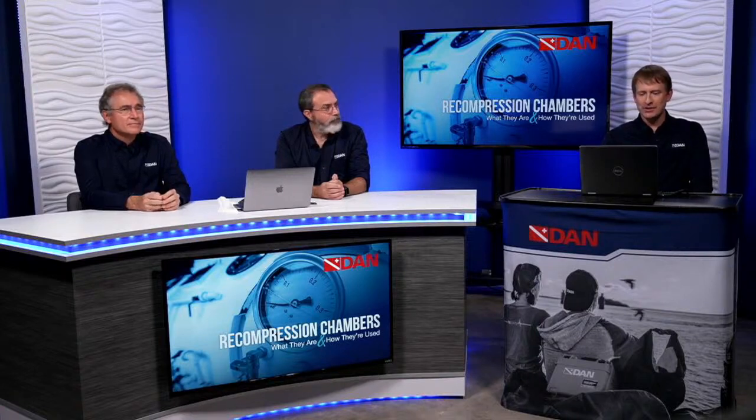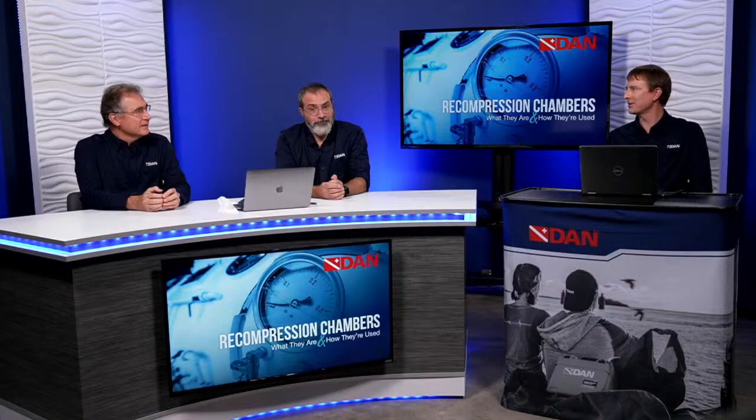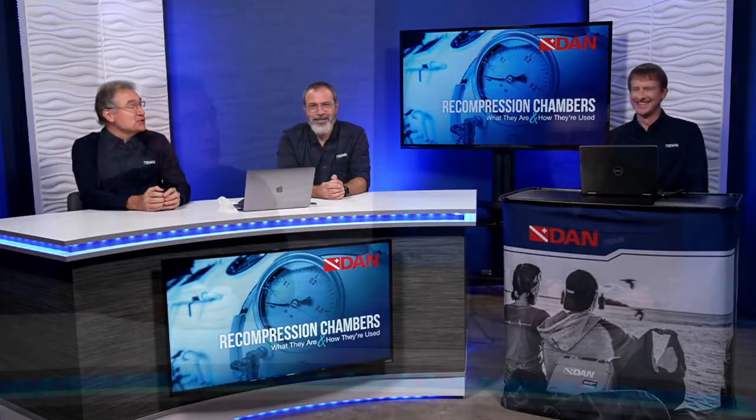All right, to the questions. Smoking in a hyperbaric chamber, good idea, bad idea? Great way to pass the time? There are two parts to that question, Brian. The first part is clearly smoking, which is a great source of heat. It's something already burning. Add a bit of oxygen, and it's not just that the cigarette will burn up a lot quicker, but we could end up with a catastrophic fire in the chamber. That's the safety side in terms of fire.